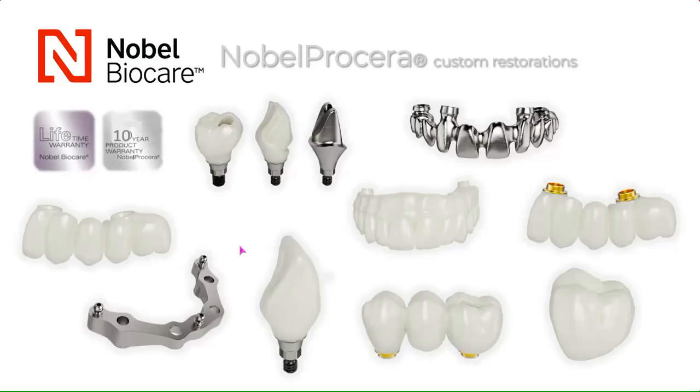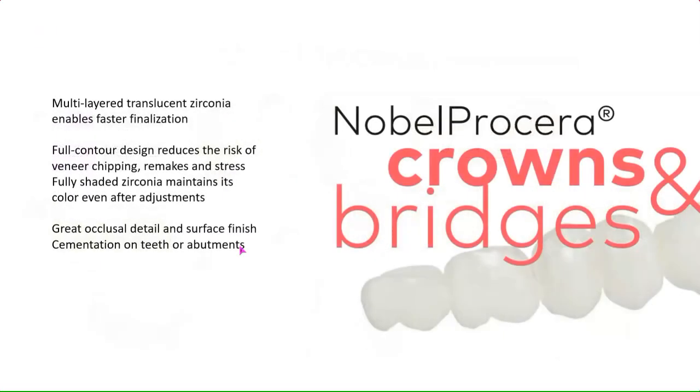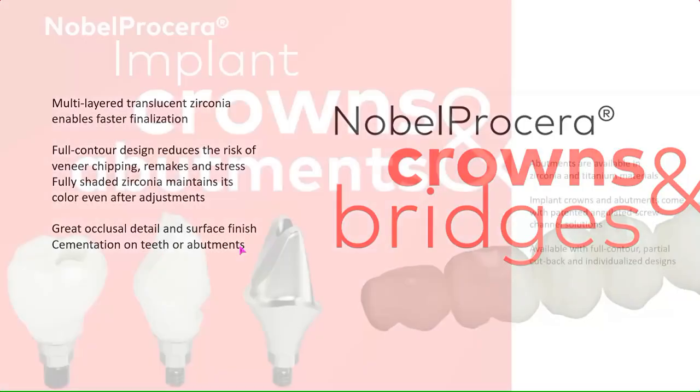And now with the design capabilities with exocad, it really partners well to have unbelievable, excellent restorations. With our zirconia, multi-layered translucent zirconia, we'll talk about that a little bit, but we do look into our material choices very closely as well to adhere to all of our tight tolerances for strength for our restorations, not only aesthetics, but of course, strength.